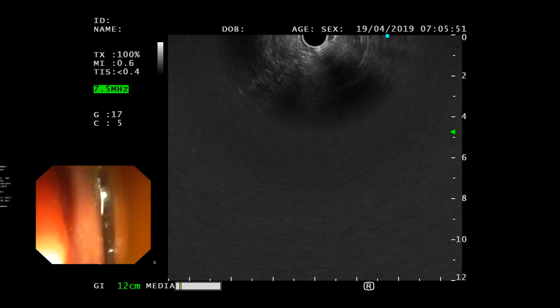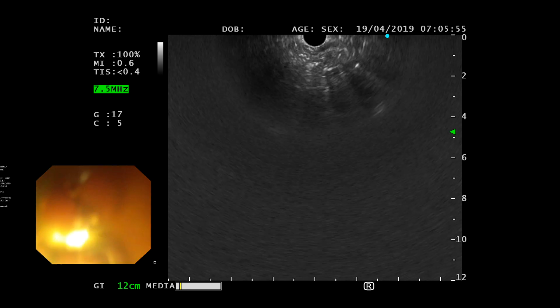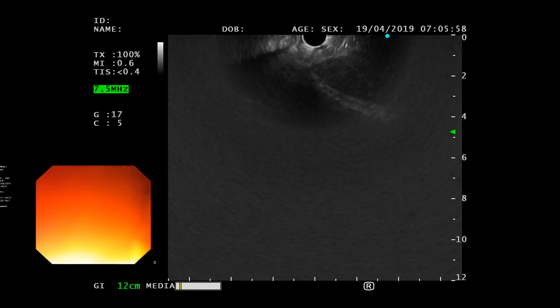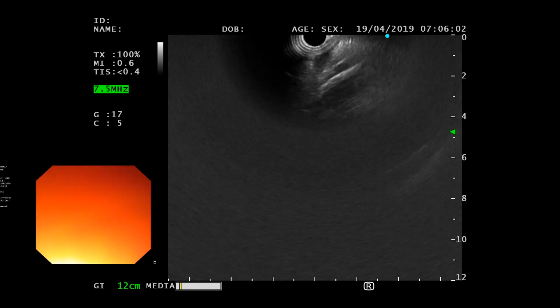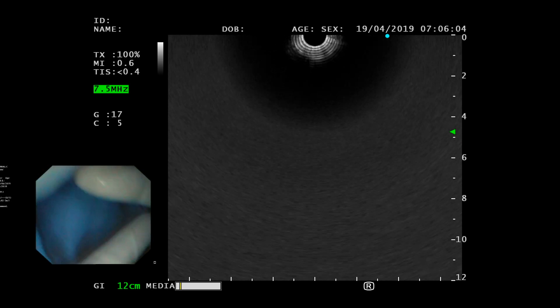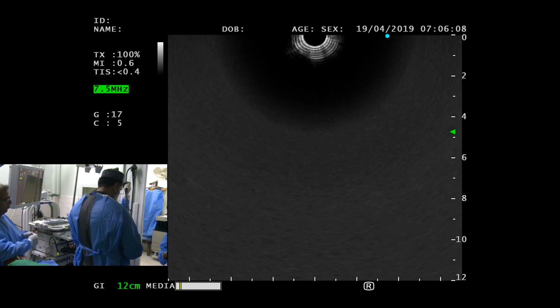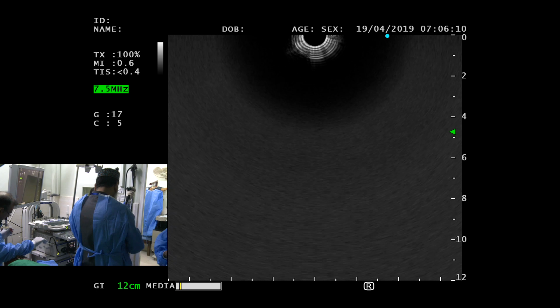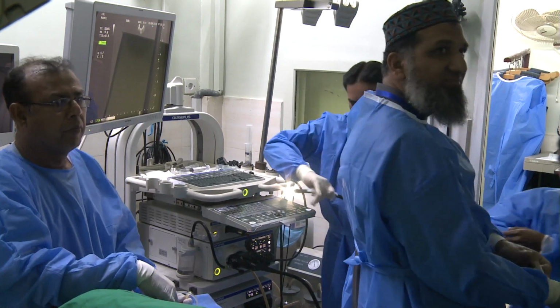Hello? We're done in this case. Yeah, we're done in this case. Thank you. Can we have the scope out, please, and move because we are already behind. Okay, right. निकाल लो. So we've already achieved most of the objectives here. Can you just report the thing with one of the doctors there, Dr. Saab, and just tell us when you're done. Come back and show us the report, please. Okay, we are done, and I'm going to get the report done. Thank you. Thank you very much.